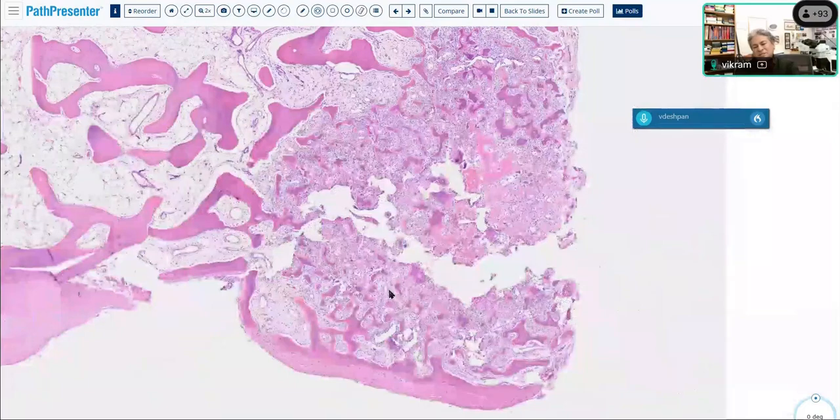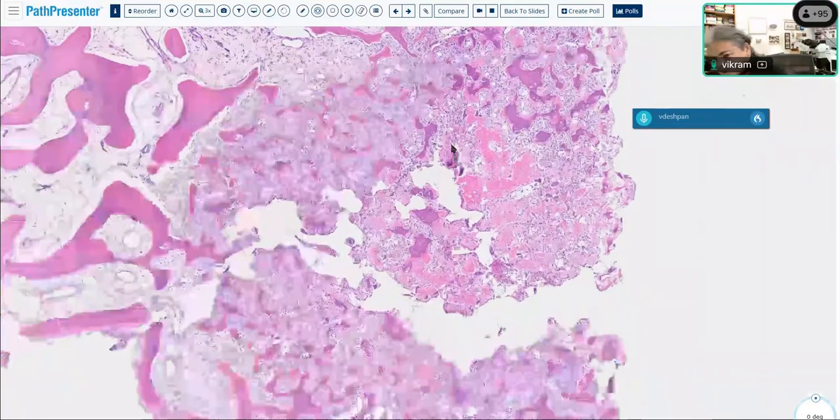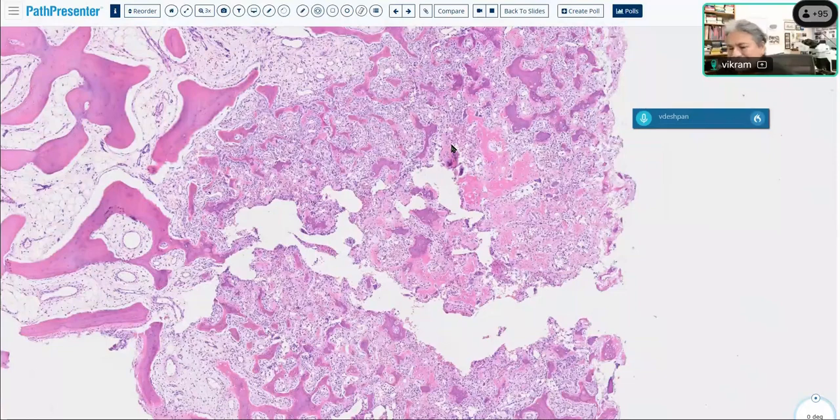Anyone know what this is? This is no tricks here. Pretty straightforward. Come on. One of you. Yay! Osteoma. Thank you. That's very helpful. Okay. Chondroblastoma is a good option. We can talk about why this is not a chondroblastoma. Osteoma, I wouldn't agree with osteoma because osteoma is a surface lesion, right? So osteoid osteoma. This is an osteoid osteoma.